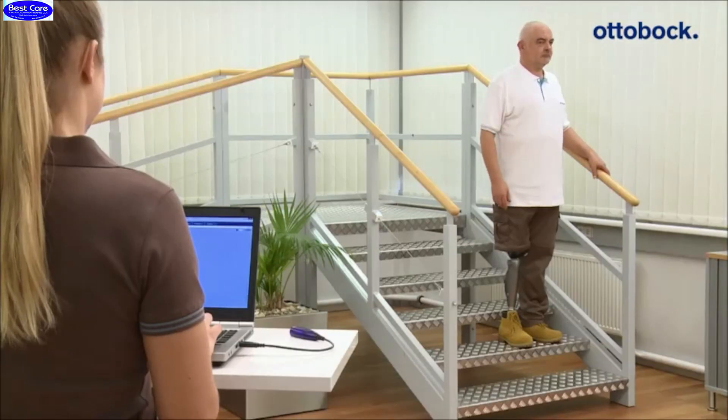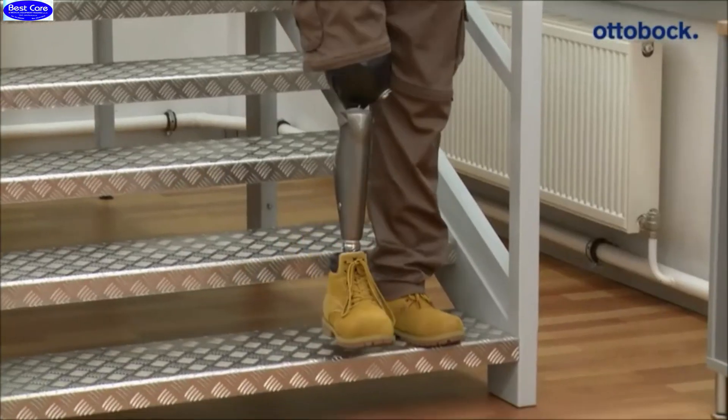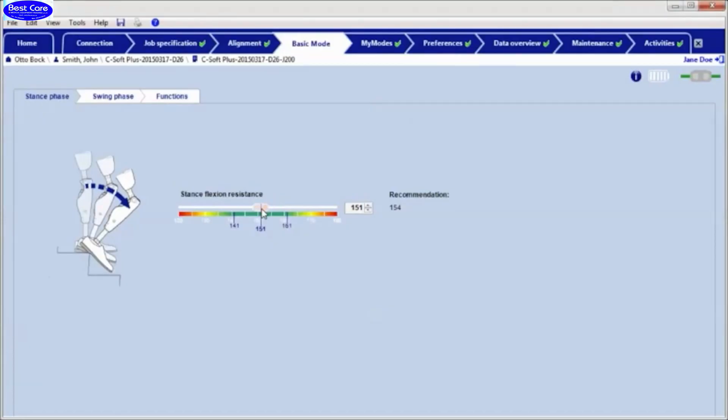In the next step, the stance flexion resistance has to be checked while going downstairs. The value should meet the patient's need. If the patient has the feeling that he is sinking down too fast, for example, the value can be adjusted in small increments via the software.